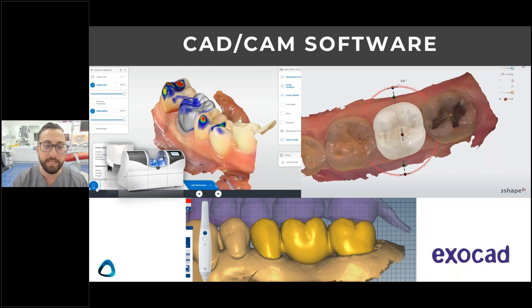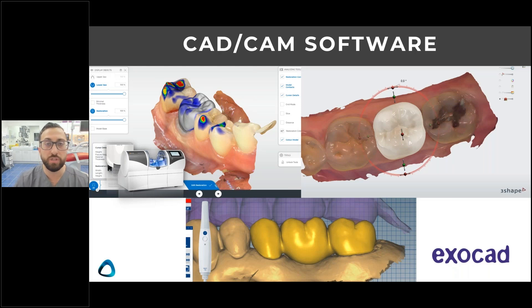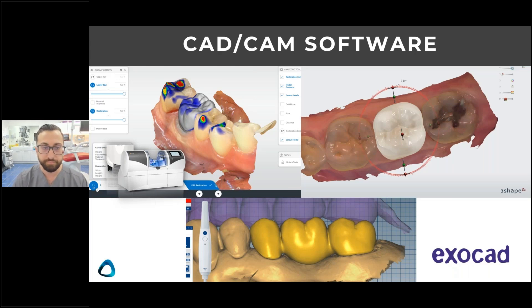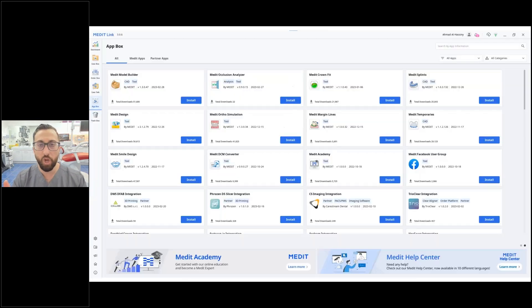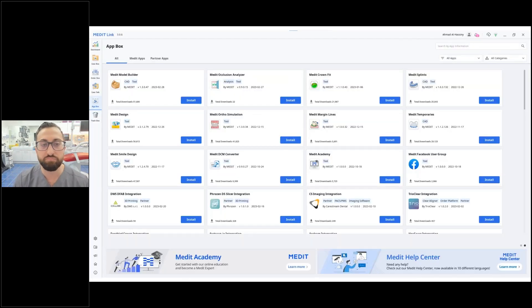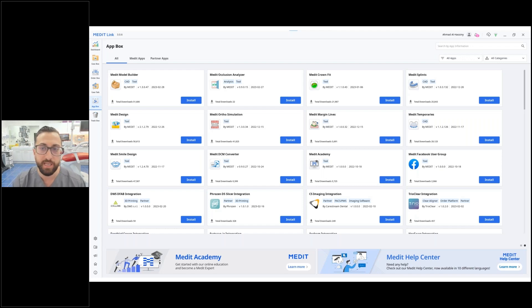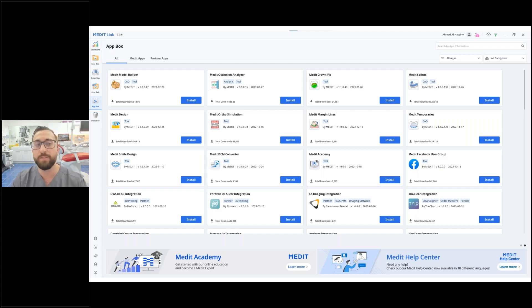With Cerec software, you cannot use Cerec Chairside with Medit, but you can use inLab with Medit. Going back to the Medit apps — this is really what makes Medit so special. You access these apps through the App Box in their software, and there's just a ton of apps there.